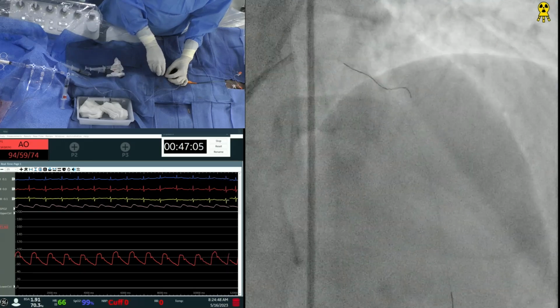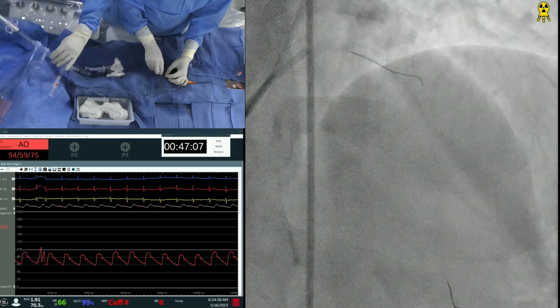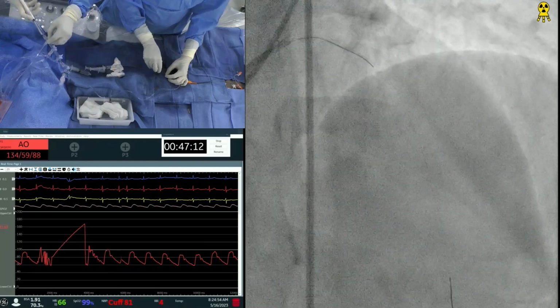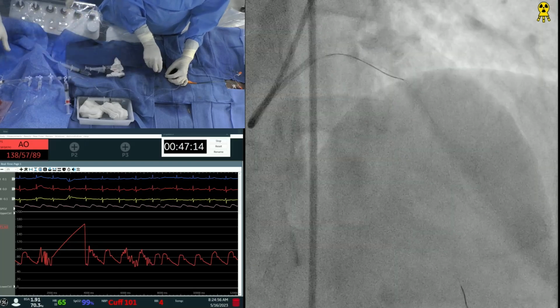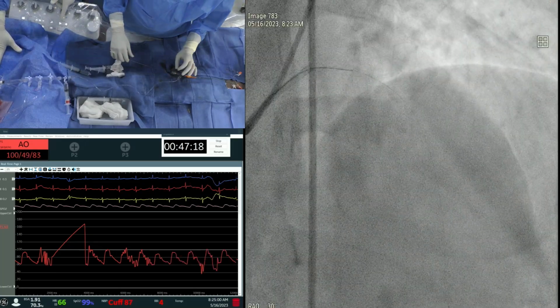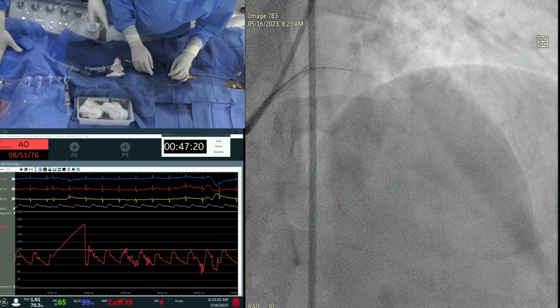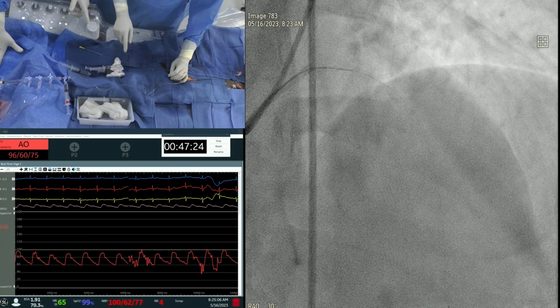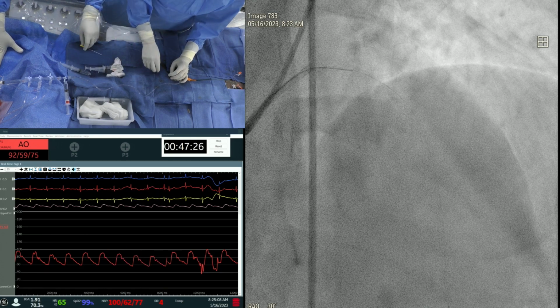Do you want to see it? It looks to be in the right place now. No, I think we will waste time and create more. So we dilate the LAD first. So what we can do is put this wire distally, so the wire remains in the distal lumen. I do think we have to balloon, then bring back and go. But let's put this wire in the distal lumen.